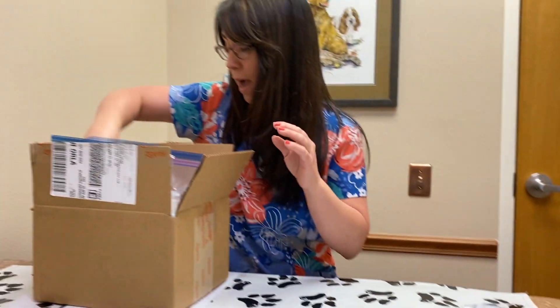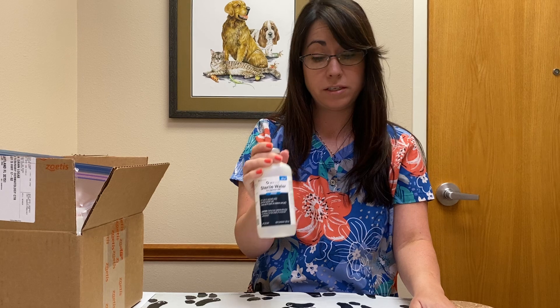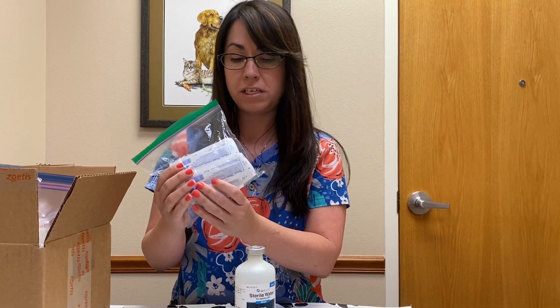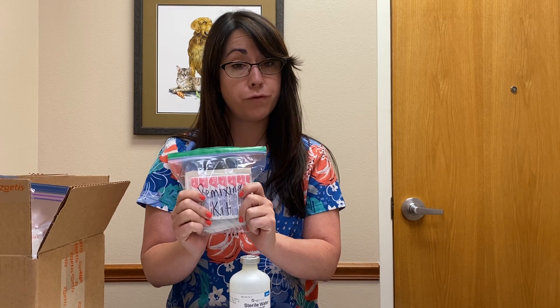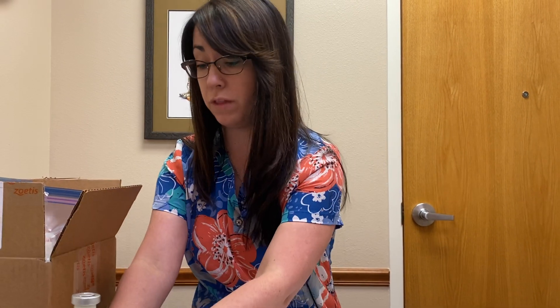You are going to have sterile water — this is what you're going to use to make that powder into liquid. You will have a remixing kit, which is just about five or ten syringes with needles. These can be reused every time you remix a bottle of the Fortas, so you only have a few of them.